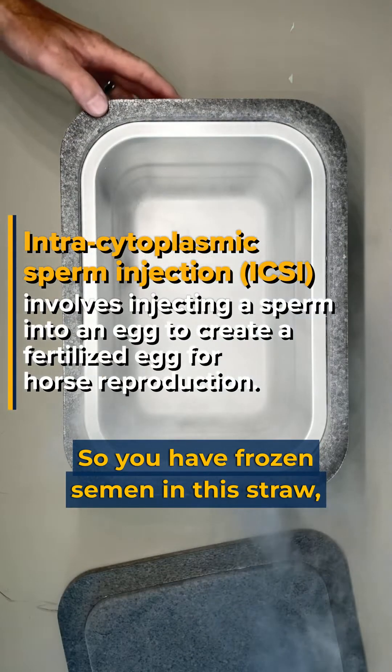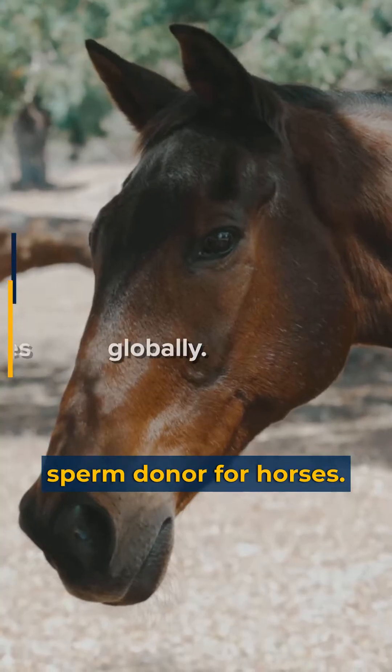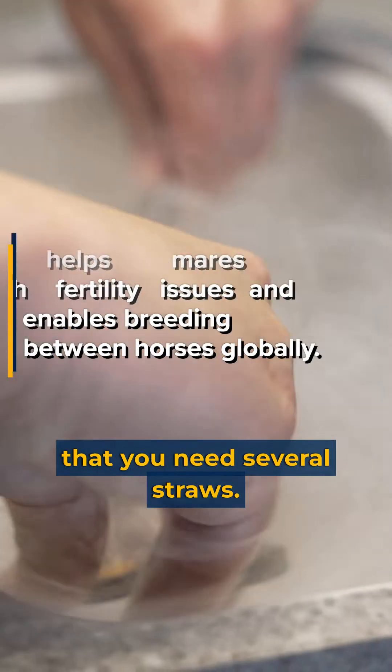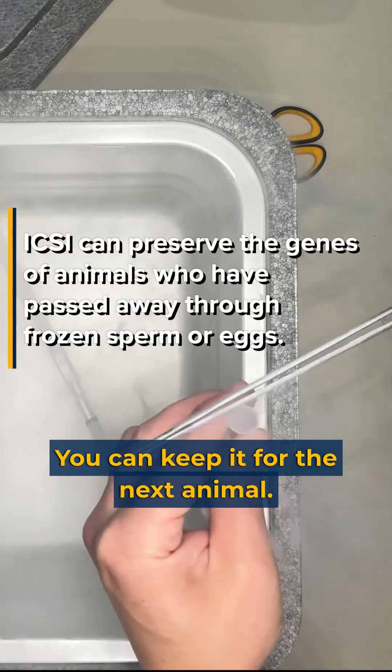You have frozen semen in this straw — it's basically a sperm donor for horses. In contrast to normal breeding where you need several straws, here we just cut a tiny piece of that straw and you can keep it for the next animal.